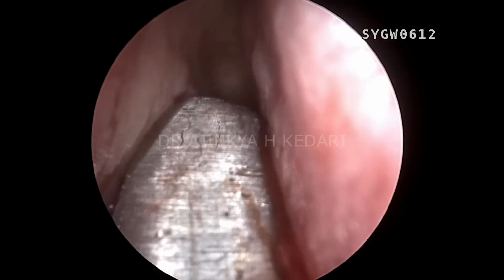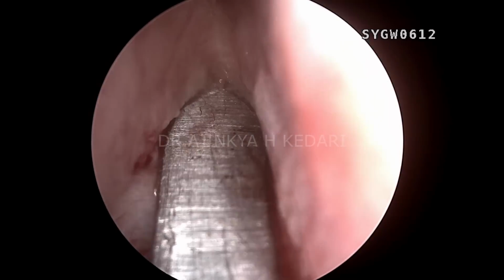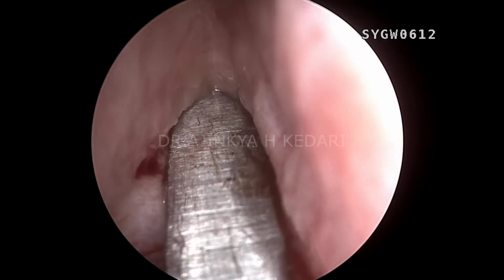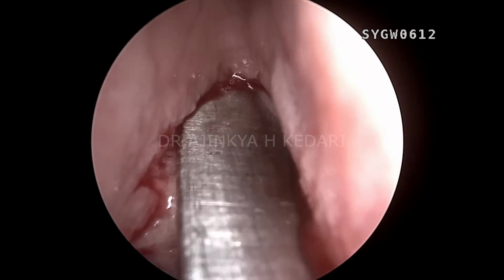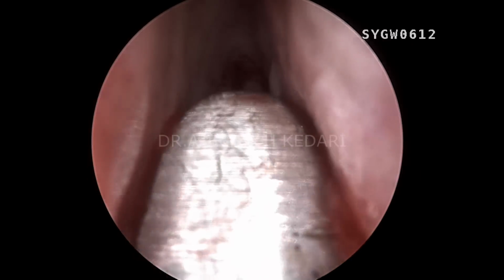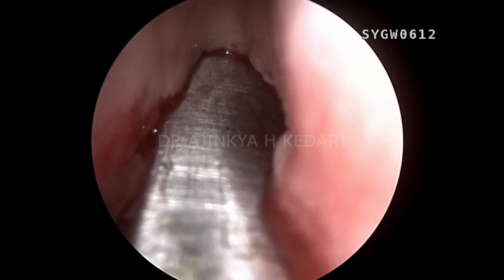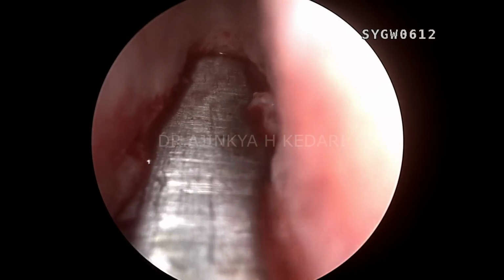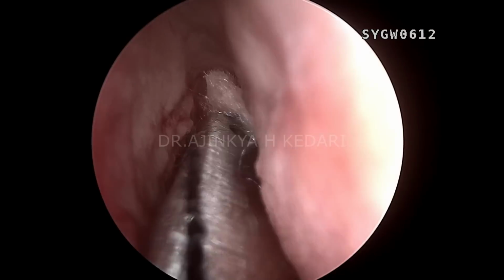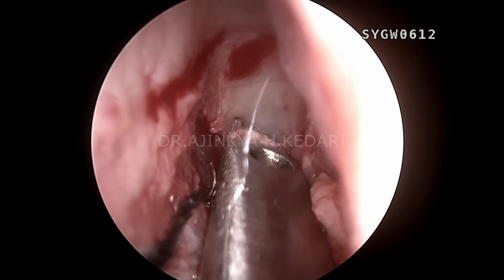Now there are many methods to do the incision here. Either you can use a Coblator to have a bloodless incision, you can use a pencil Colorado-tip needle for cautery, or you can just use a normal Freer, put pressure against it and elevate the mucosa along with a Freer suction. I've chosen to do it with a Freer, along with a Freer suction, and you can see I'm using a neuropatty.